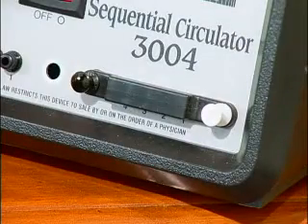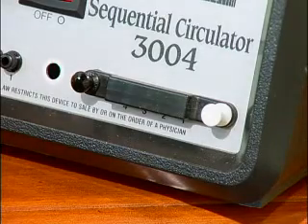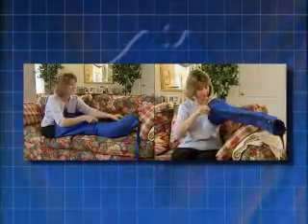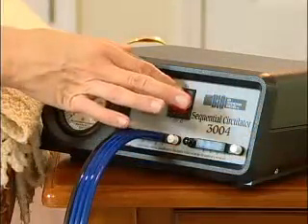If you are only using 1 sleeve, you must leave the cover on the second connection, otherwise the pump will not function properly. Before turning on the unit, unzip the sleeve and place it on your arm or leg. You may use the sleeve over light clothing if necessary. Zip up the sleeve and make sure it fits properly. Now, turn on the unit.